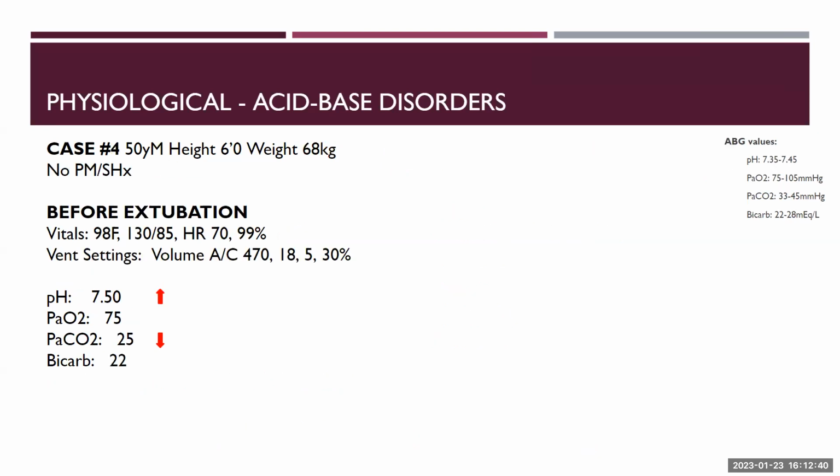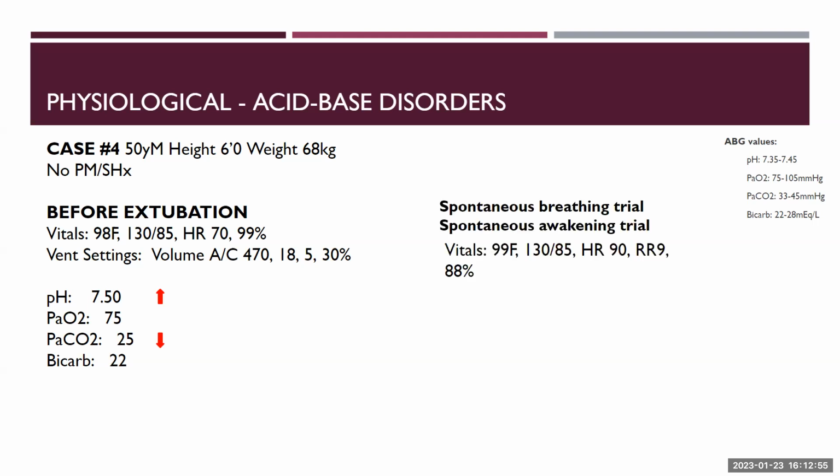So this is our last case, I believe. This is a 50-year-old man. Let's say that we're going back to our first patient. We're thinking about extubating, and these are his last vitals. And then we start doing the spontaneous breathing trial and spontaneous awakening trial.